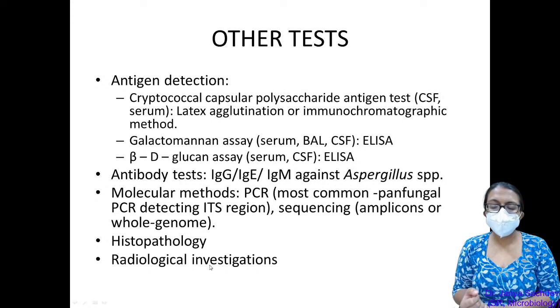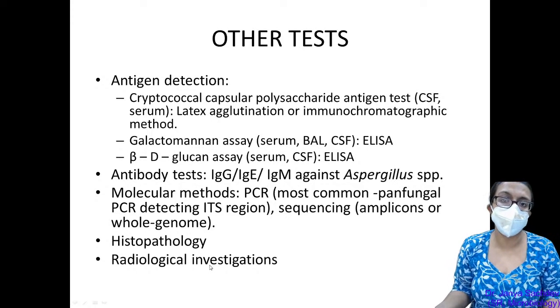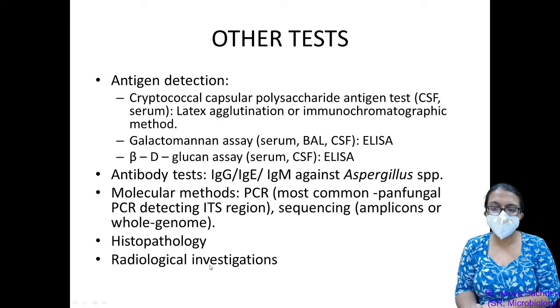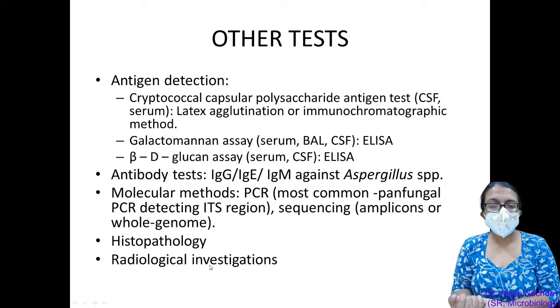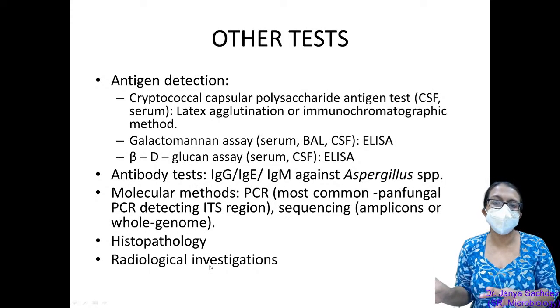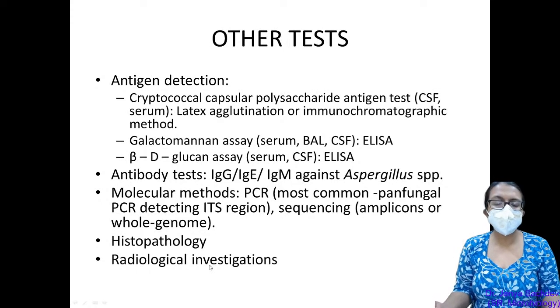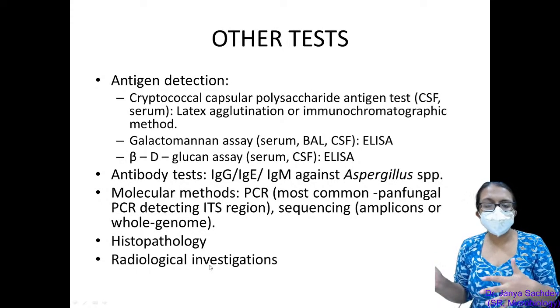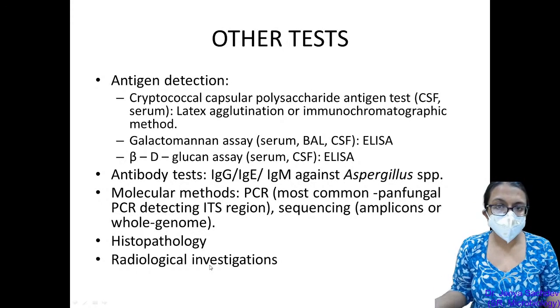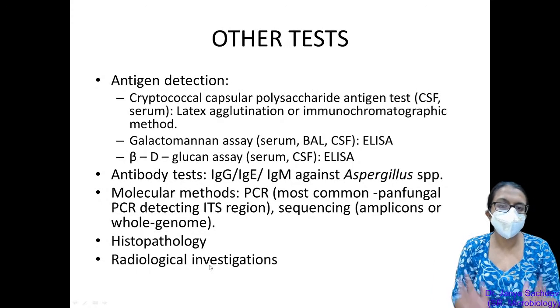The other take-home messages which you need for mycology are: direct microscopy is hugely important because of the slow growing and sometimes not growing fungi which we encounter. So direct microscopy is very important. In many cases, direct microscopy is taken as evidence of fungal infection even if fungi are not grown in culture. So if you get a report of direct microscopy positive, don't delay treatment and don't wait for a culture report which may never come or may come very late. The way you would do, say, in bacteriology, would wait for a culture report to start treating. Don't do that in fungi.